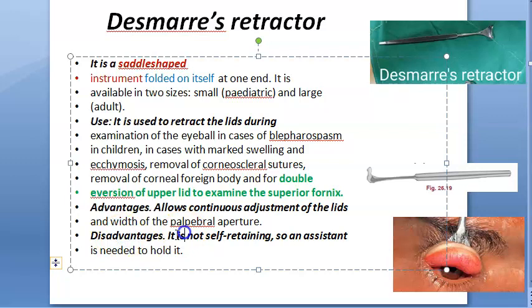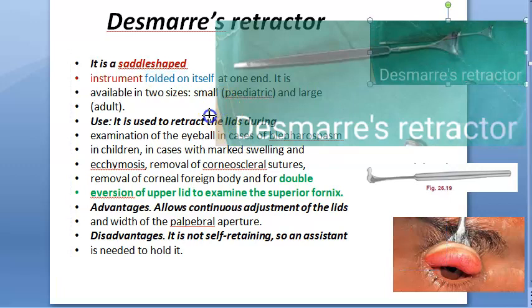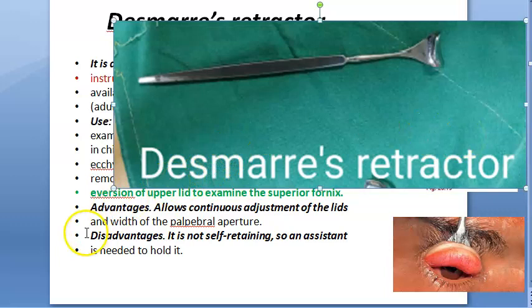Disadvantage: it's not self-retaining. Somebody has to keep it pulled. So if you are doing something, somebody has to keep it pulled on the other side. Also, when we say it folds on itself — it's metal only. It's not flexible; you're not going to bend it and fold it.